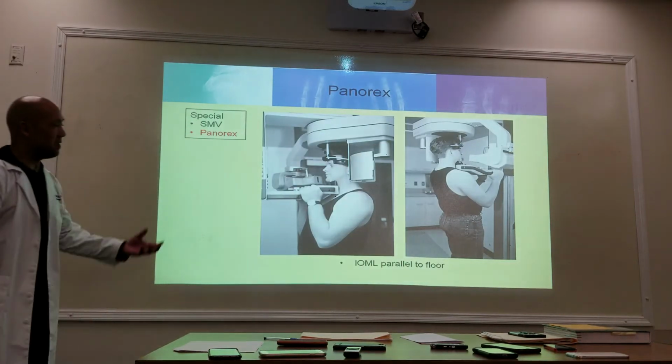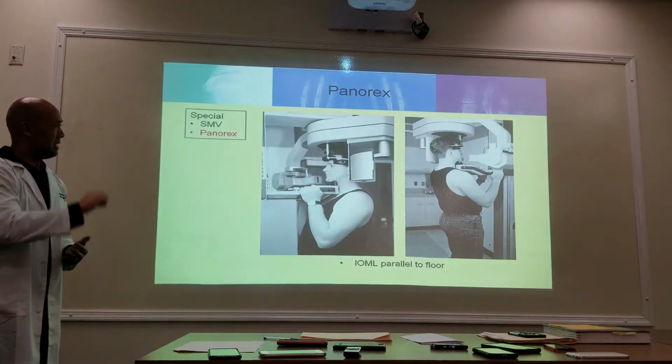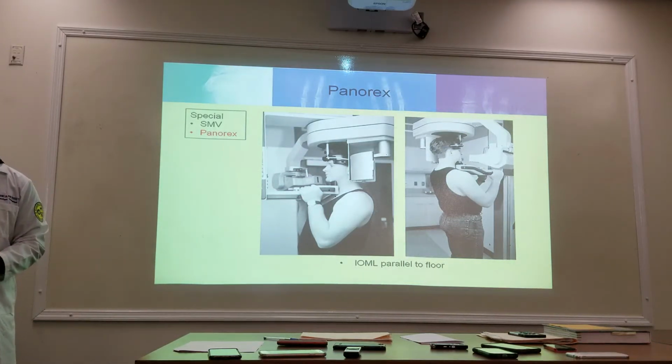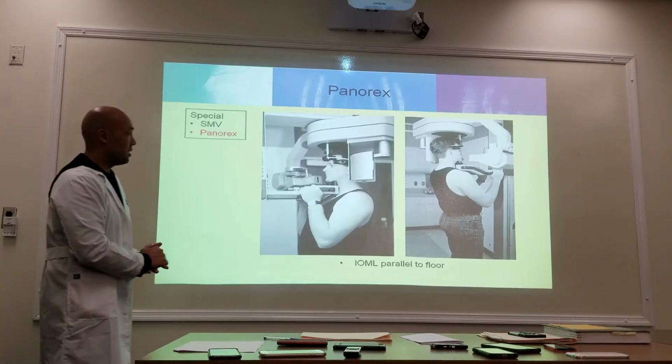The cassette is very unique. It's a curved cassette. And again, it makes an exposure around your face. And for the proper positioning for a Panorex, some of you have these at your facilities and you may be using this.